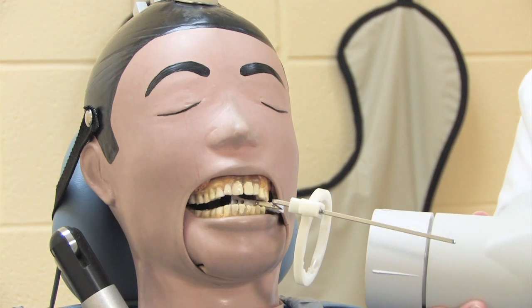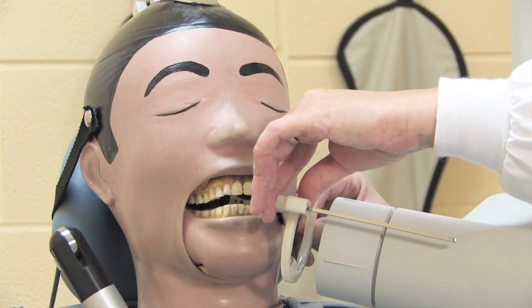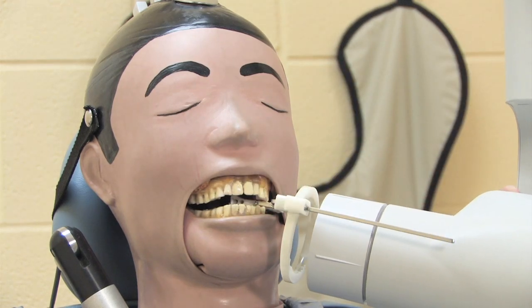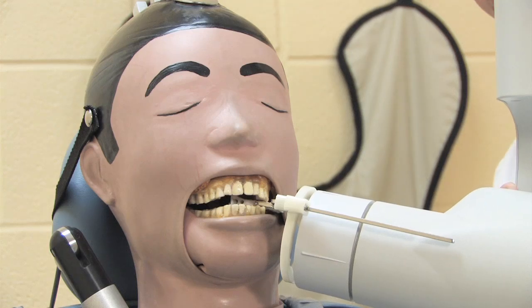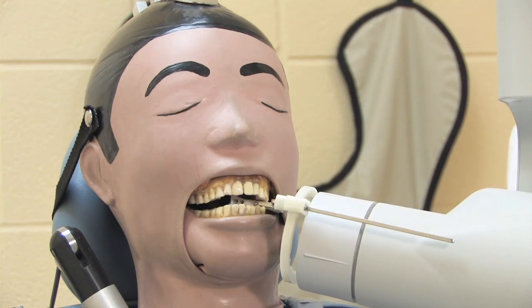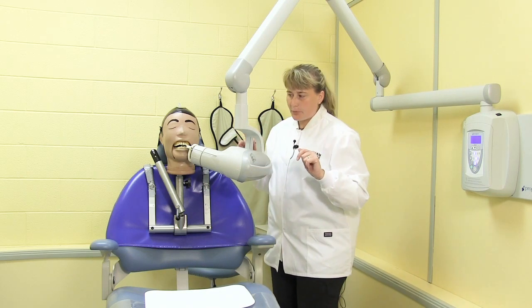The tube head and PID are brought in, and the ring is nice and close to the client. The PID is positioned flush with the ring for correct horizontal and vertical angulation. I would then exit the room for exposure.